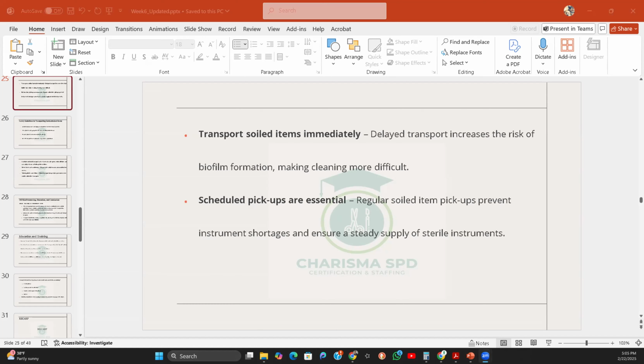It's just an open space where they place the instrument set and then transport it to wherever it is going. But once the dirty instrument goes through the cart washer, it is safe enough to carry the next clean item back into the OR. So that is why I was looking for the decontamination process as the only condition under which a cart that came with a dirty instrument can go back to the OR with clean instruments.